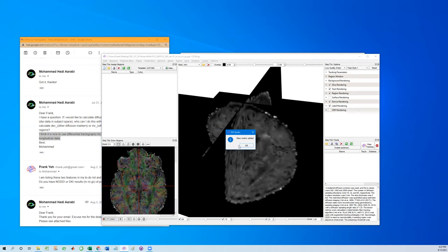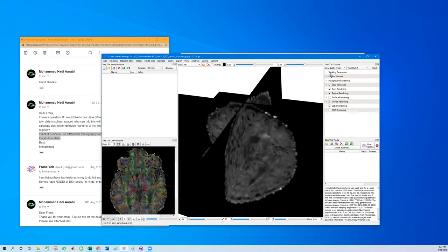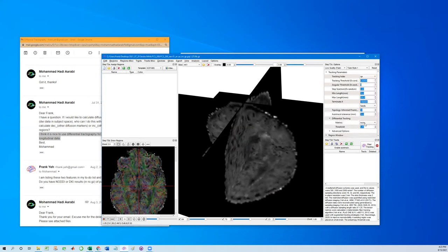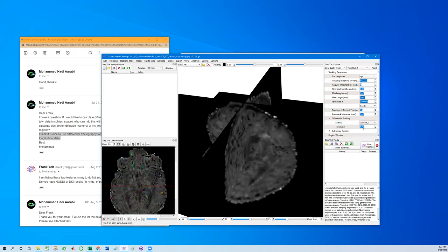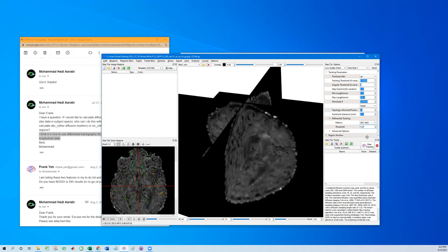If everything matches, then it shows new metrics added. The new name will appear on the metrics of the differential tracking. So here we set that this metric and assign 0.2, which means 20% decrease between AK1 and AK2. And then make sure to increase a little bit of the minimum length to remove fragmented results, and also have enough seed points and step factor for tracking.